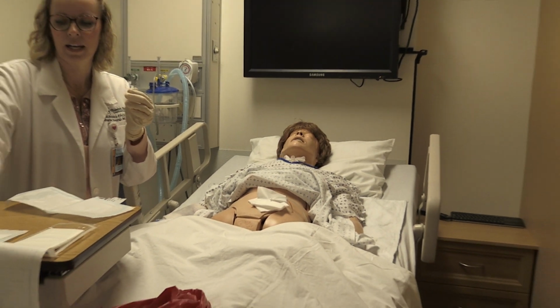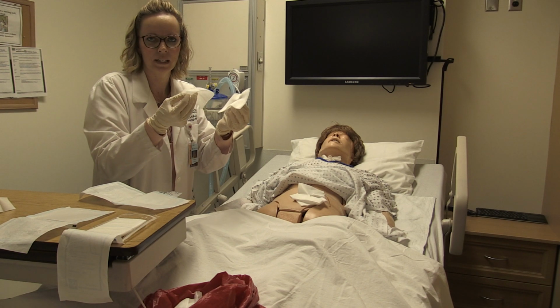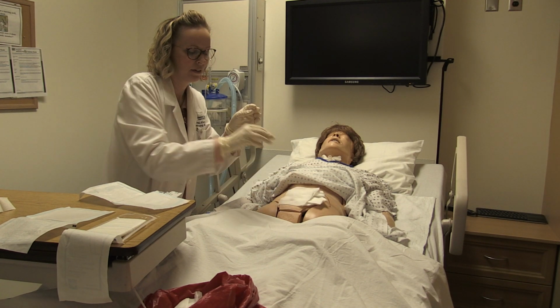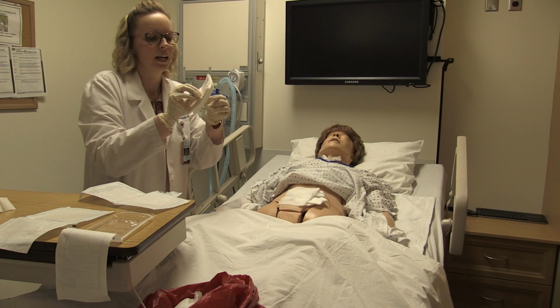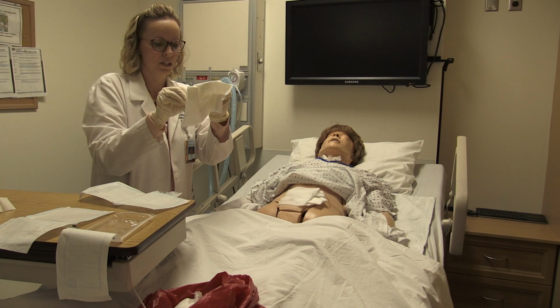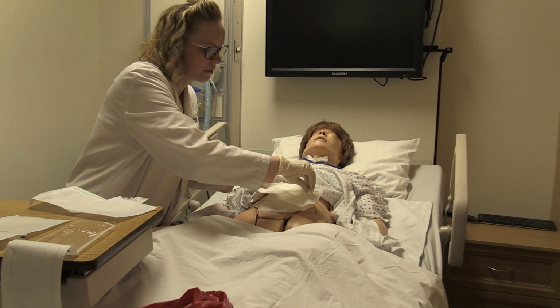Then I'm gonna take my gauze, there's 2 of them here, and this is gonna go over the midline incision. It's already kind of covered, but we're gonna give it a little bit of extra padding. And then I'm going to take my abdominal dressing pad, and at this point everything is covered, but we're just going to touch the outside portion here. And you can go this way or that way. I like to go this, it kind of covers a little bit more.